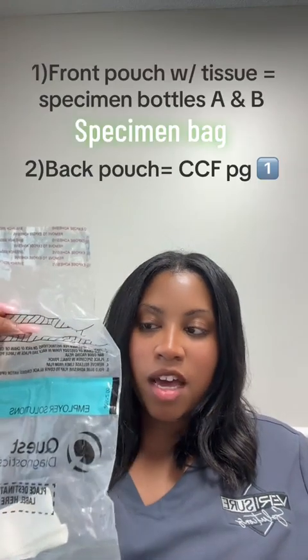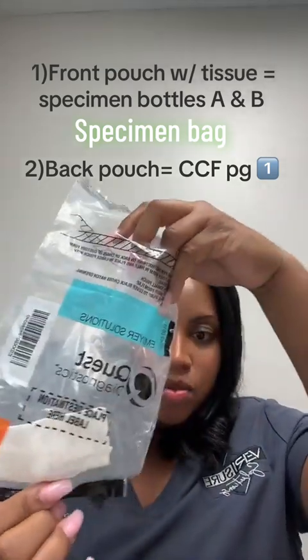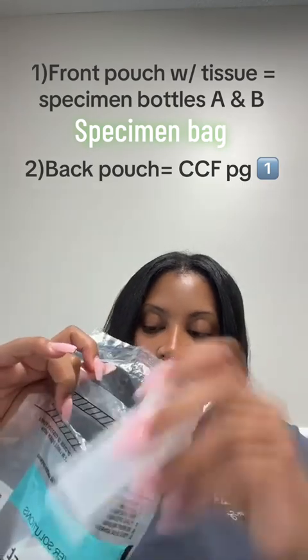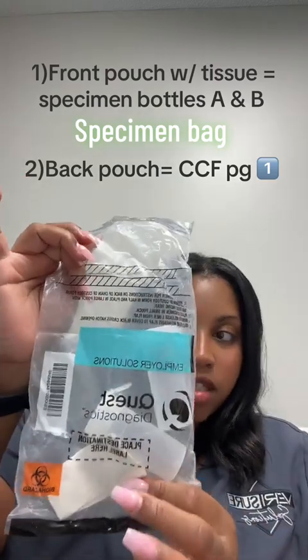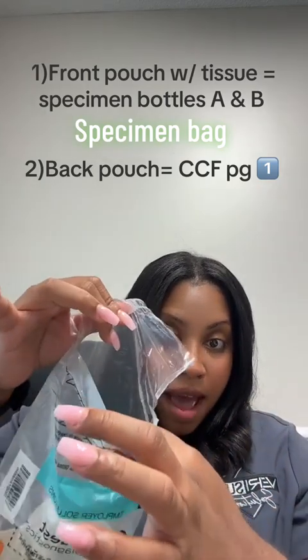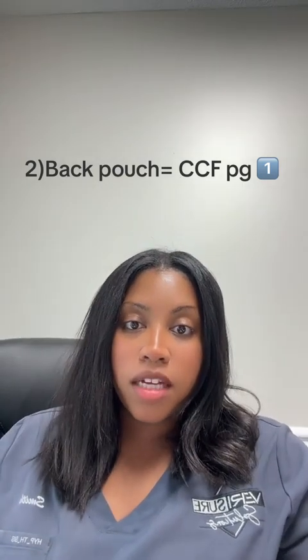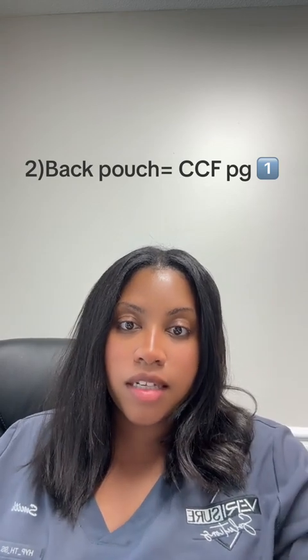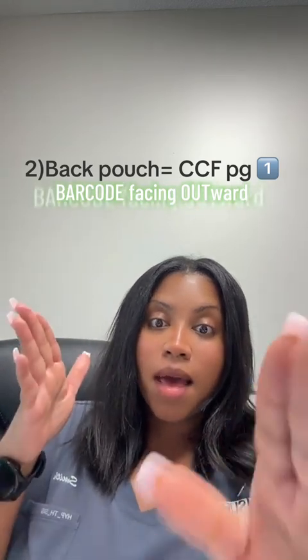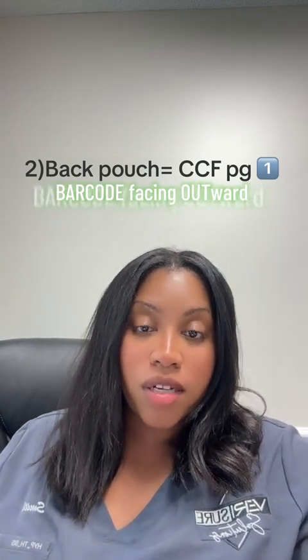So your specimen bag will look something like this. You're going to go ahead and take both of those urine samples, and you see this white tissue here inside. That is the pocket that the specimen bottles are going to go into, because it's 2 pockets. The other pocket is going to hold the CCF copy. So you're going to take page 1 of your CCF and put it inside that specimen bag with the barcode label facing outward, so when it gets to the lab, they're able to scan it without having to open the bag. The barcode facing outward is going to look like this.